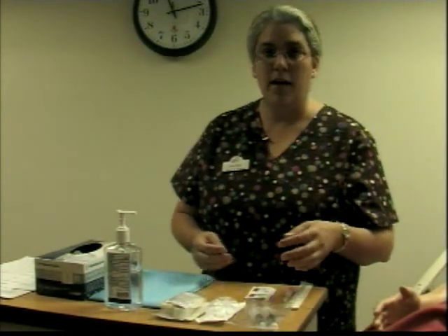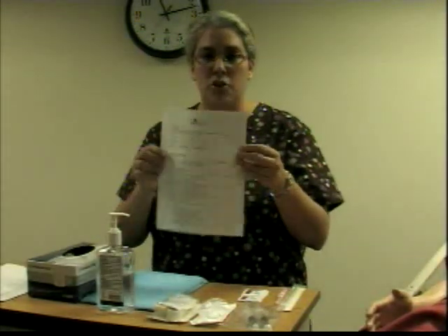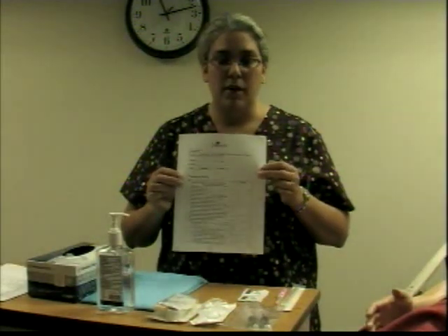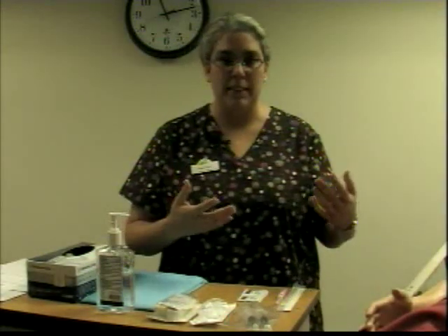Today we're going to learn how to start an IV, or insert an IV, on a client. You will have your student checklist and a WebCT that will give you step by step of the important things that we'll be looking at as we perform this skill.